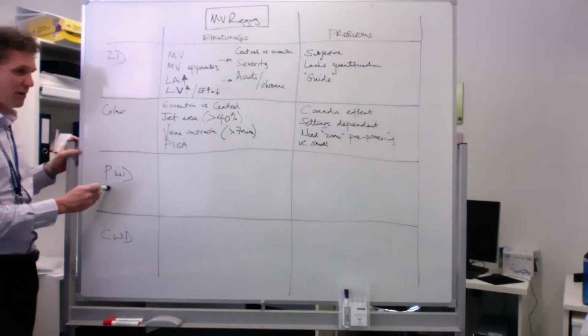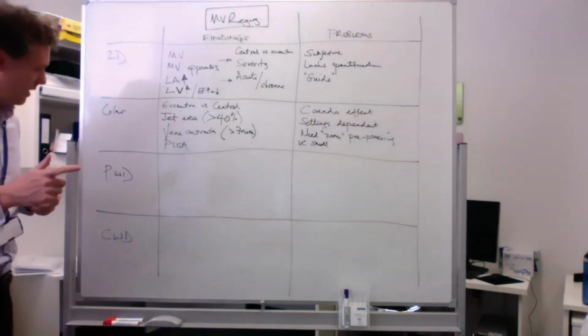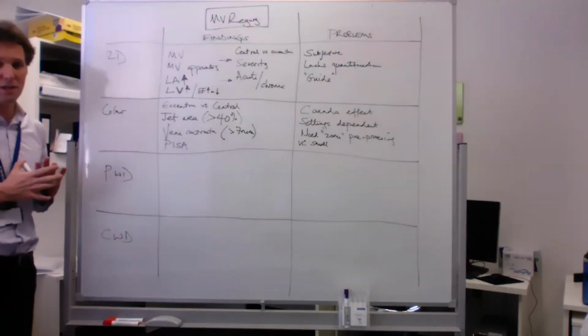Okay, pulse wave Doppler. Who's next? Thanks, Lewis. Cheers, man. Raymond. How can we use pulse wave Doppler to assess mitral regurg?